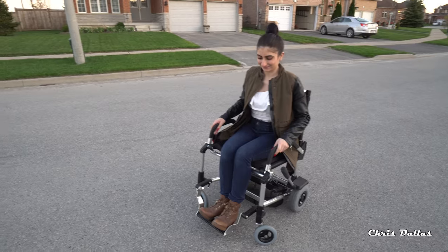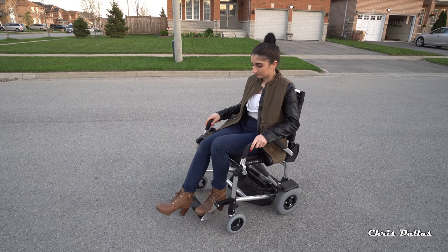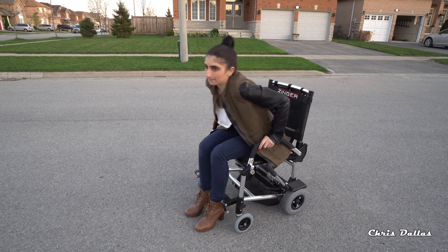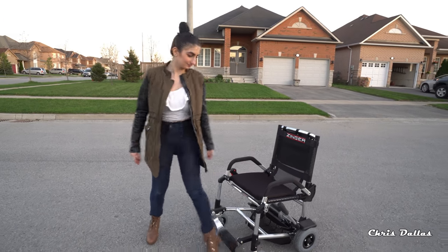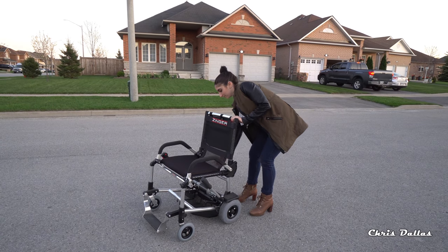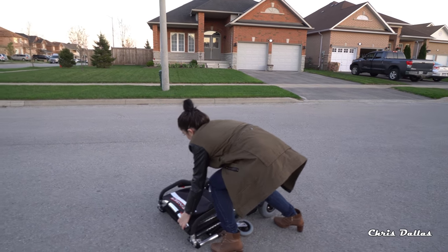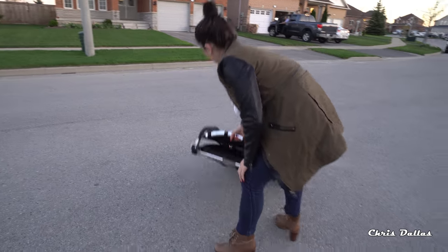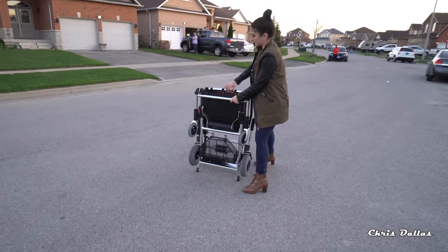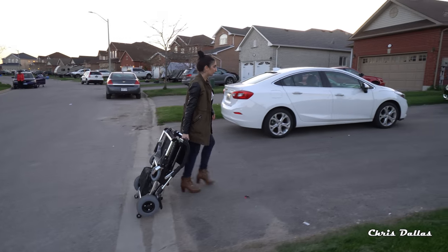Show them how easy it is for the footrest to go back and forth. There's your footrest — get up, put your feet forward, and that's it. Push it backwards. Now you can fold it all the way down. It's about 38 pounds. You can pull it like a suitcase.